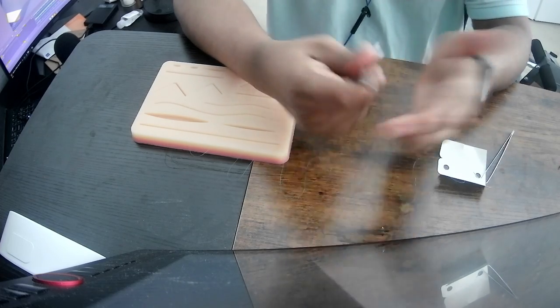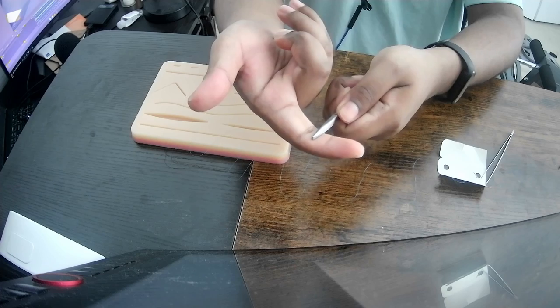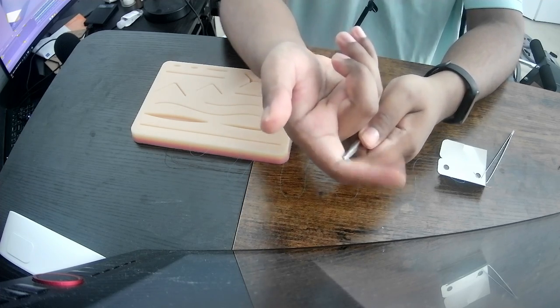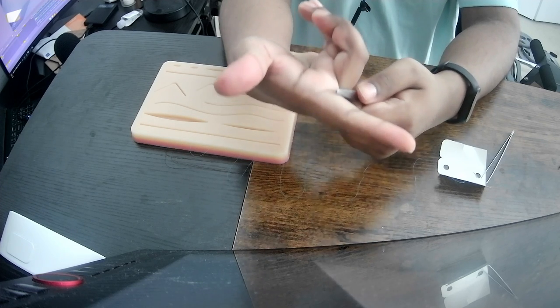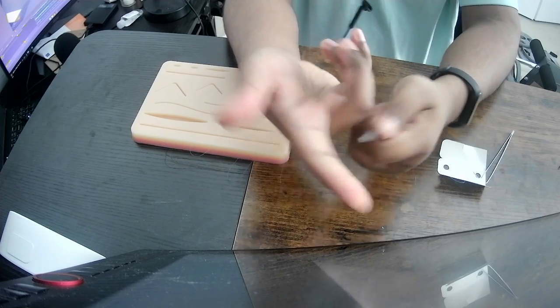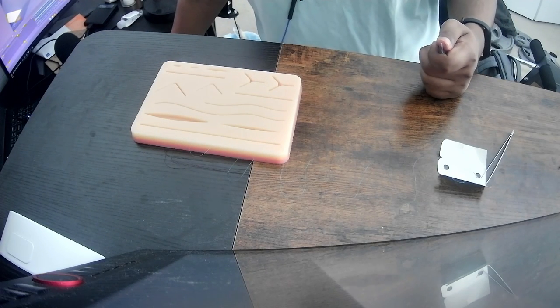And the other thing they mentioned was where I load the needle. So it's like this, where I load the needle. If it's just to the middle, I only get this much to bite into the skin, right? Versus at the edge, I get this whole area to bite. Okay. I think I'm ready to start.